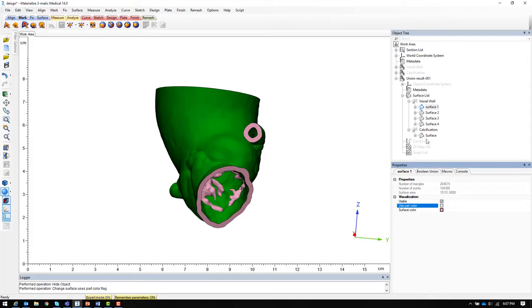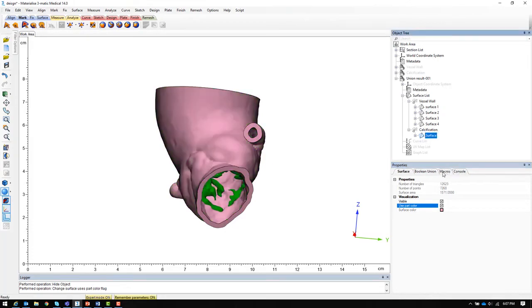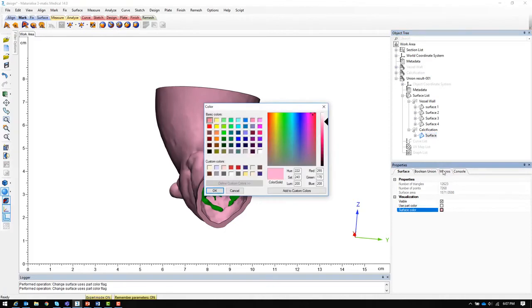In this case pink for the vessel wall makes sense, so I will simply change the color for the calcification surface.